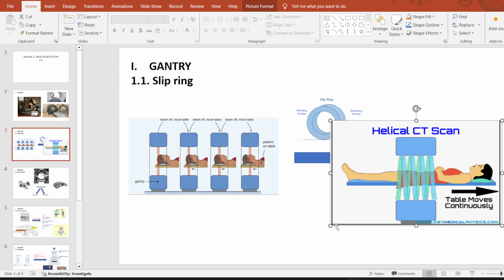So altogether, I just want one conclusion about the slip ring. Slip ring is a vital technology related to modern CT models because it helps modern CT models rotate the tube continuously. Just like that, my friend. Simple. Take it simple, because simple is the goal of this whole lecture. Alright? That's all about the slip ring.